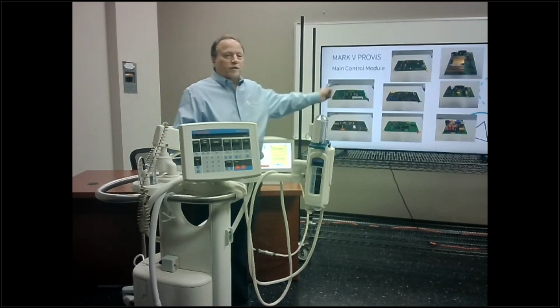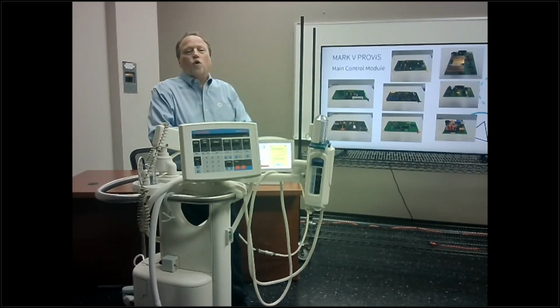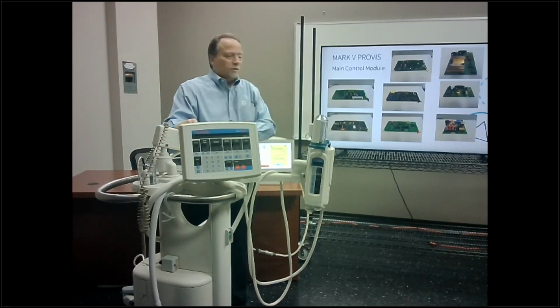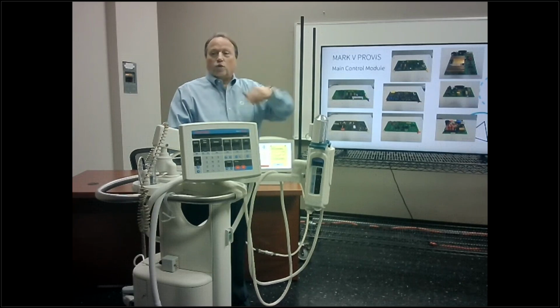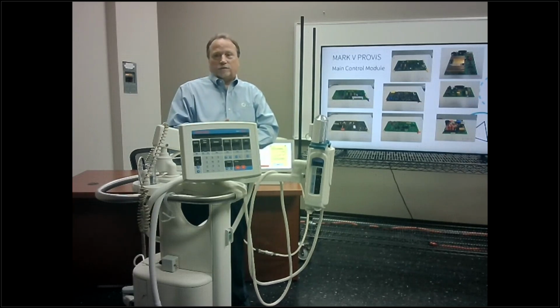Now you see all these boards here? This is old electronics. All these boards now will be fit on 2 or 3 boards long. There's actually 2 more boards that go in here. So remember, when you're working on this, it's old technology.